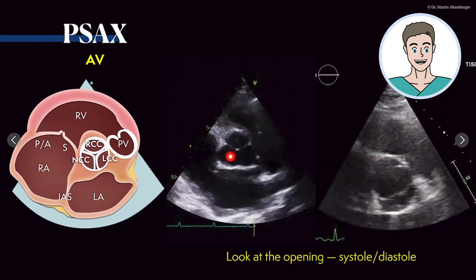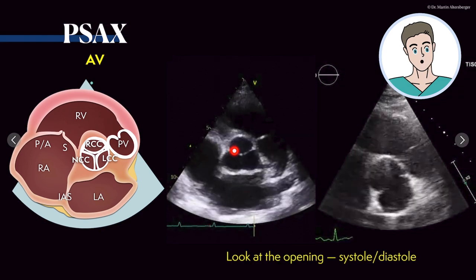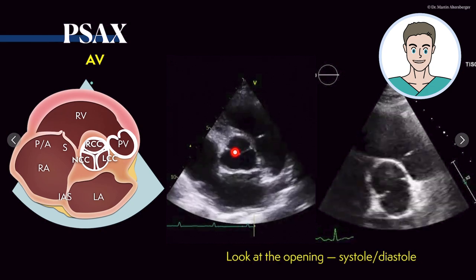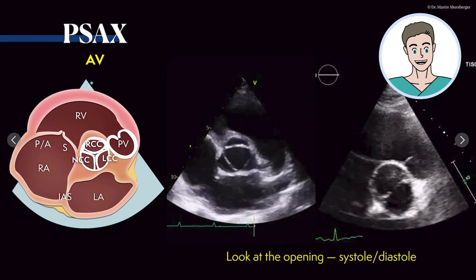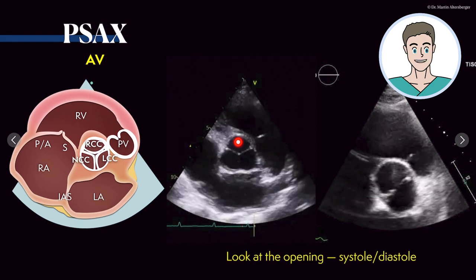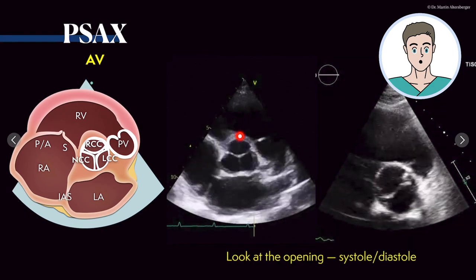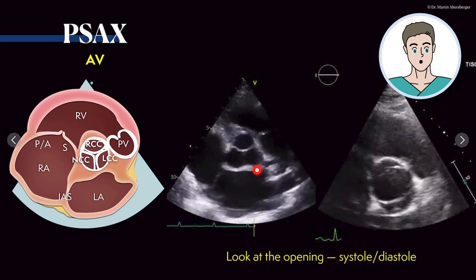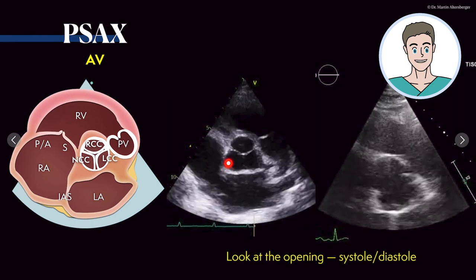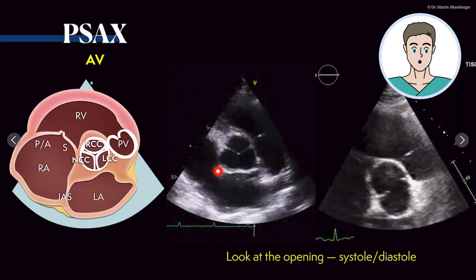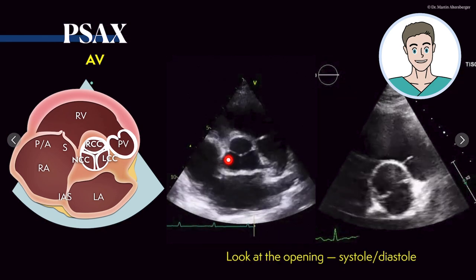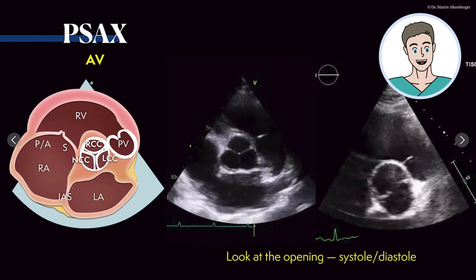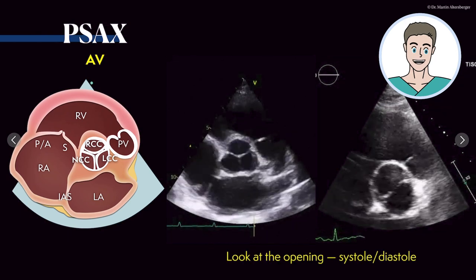Here you see the aortic valve with a normal opening. The leaflets or cusps are normal. The surface seen here is smooth and there are three of them. The right coronary cusp pointing towards the right ventricle or the RVOT, the left coronary cusp towards the left atrium, and the non-coronary cusp towards the interatrial septum. When you see something like this, you're definitely sure the opening of the aortic valve is still normal.